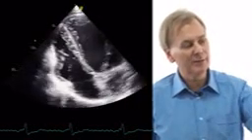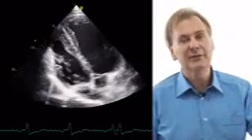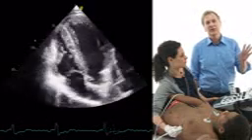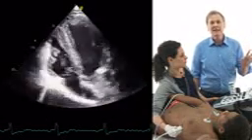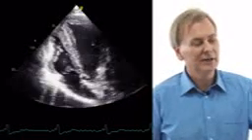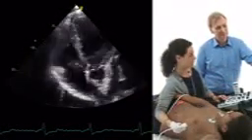So now you're more perpendicular, which gives you more echoes and which allows you to see the right ventricle much, much better. Now, in him, we get good image quality even in a normal 4-chamber view. But in many individuals with this slanted view that Anna is showing you right now, you would get a much, much better view. Yes, Thomas, and when we want to measure the ventricle, it's extremely simple.